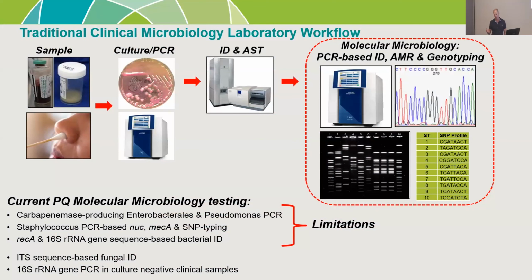As many of you are probably familiar with, the standard pathology setting in terms of micro is really collecting the samples and using techniques that we've used for a very long time now. From say bacteriology, we grow the bacteria up on plates and still use the same equipment. I had a 15-year hiatus in research, and they were still using the same bits of equipment they were when I came back 3 years ago. Obviously, we do a lot of PCR testing now directly from samples, and that really revolutionized, 20, 30 years ago, how we did things in the lab. But effectively, things haven't really changed that much.